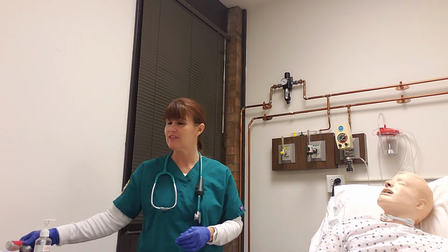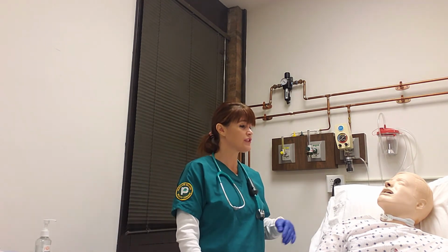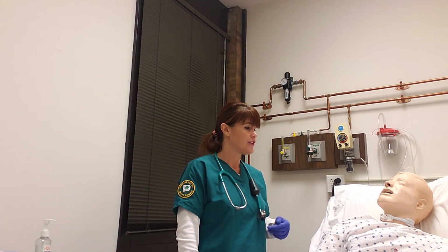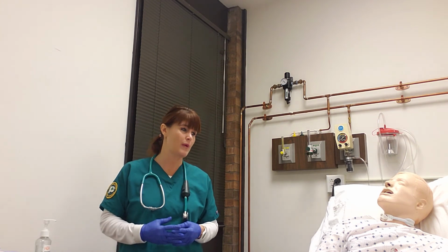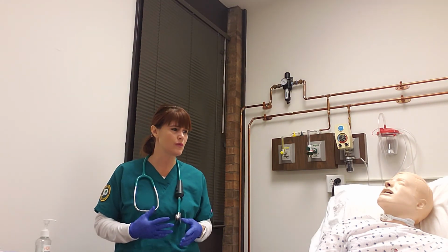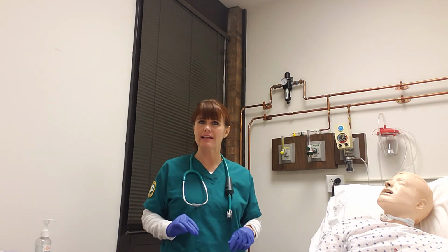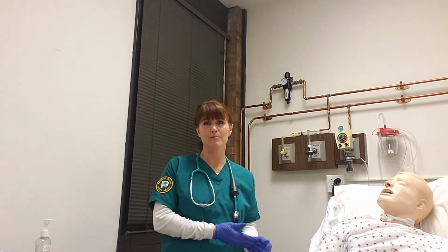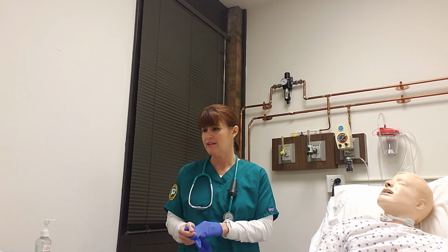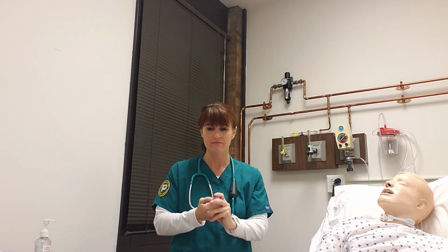So after they demonstrate that they know what they're doing, you're going to reassess your patient. You're going to get their pulse, you're going to get their respiratory rate, you're going to listen to their breath sounds, and you're going to take a peak flow. And at all times when you're assessing a patient, from when you first walk in the room, you always want to make sure that you're watching for their work of breathing, and you're checking their skin color. All these things are very important. And then before you leave, remove your gloves and do proper hand hygiene. Alrighty.